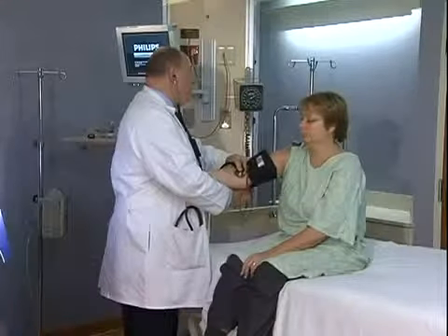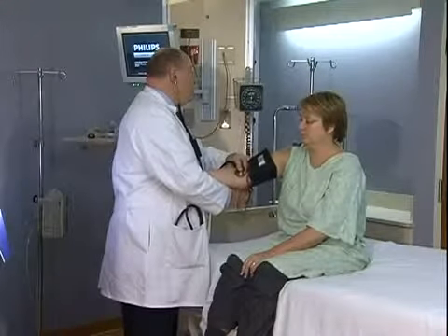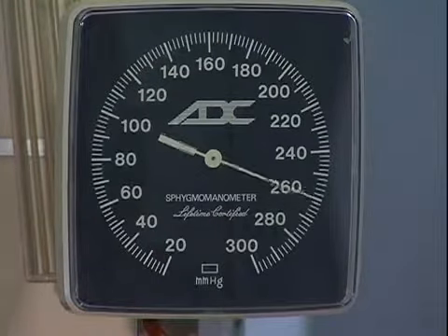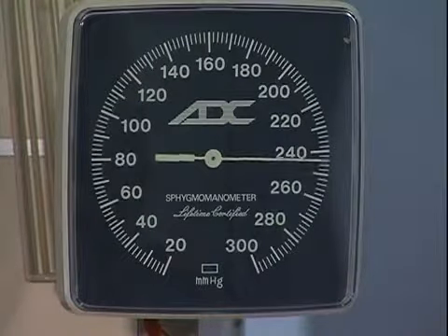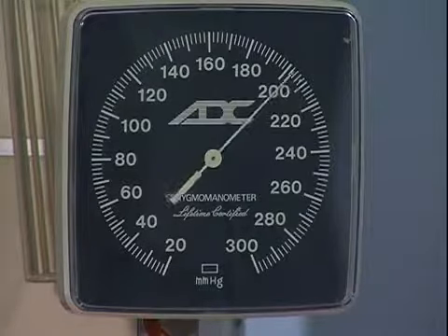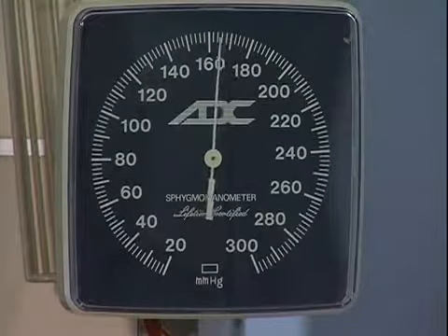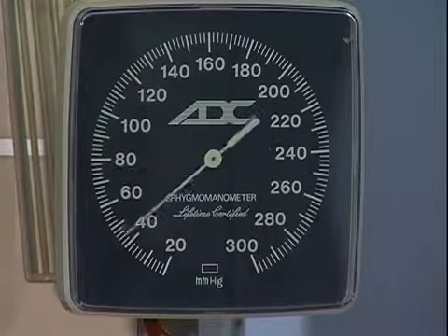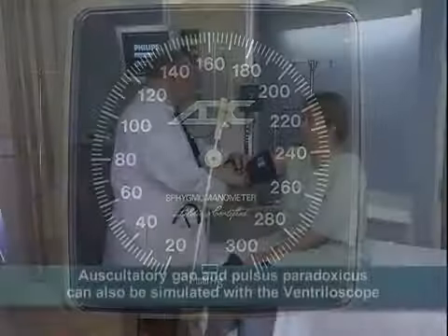First, we'll pump up the cuff. And we'll simulate a blood pressure of 242 over 146. As the needle hits 242, we'll start the Korotkoff sounds, button B1. And when the needle reaches 146, we'll let go of the button, simulating the cessation of Korotkoff sounds.